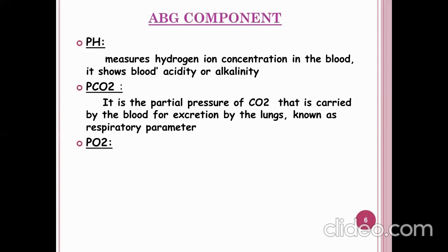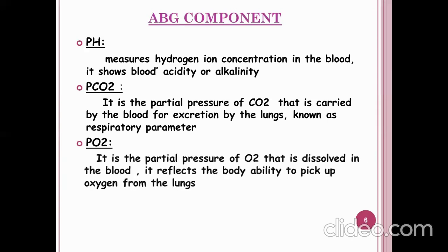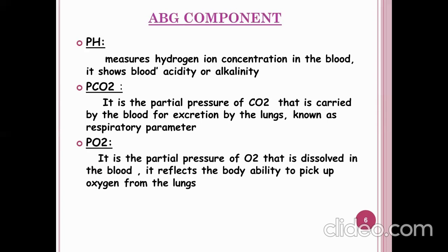Another one is PO2, the partial pressure of oxygen that is dissolved in the blood. It reflects the body's ability to pick up oxygen from the lungs.